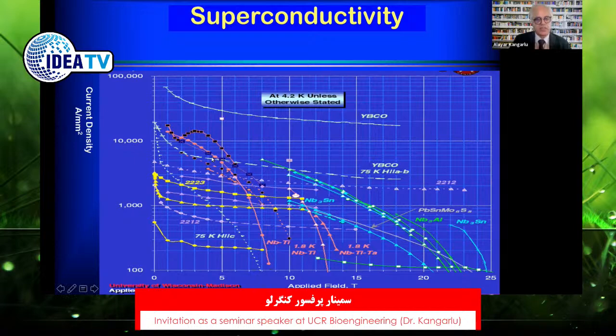Of course, you can only do so much because of resistance. As you increase the field, the electric current, and here you see you're looking at very high current density, amps per millimeter square, as you push the electric current, you are generating more heat, and normal conducting wires like copper basically fail to be useful and practical beyond roughly half a Tesla. And as a result, we have to have a paradigm shift of moving to superconducting material.